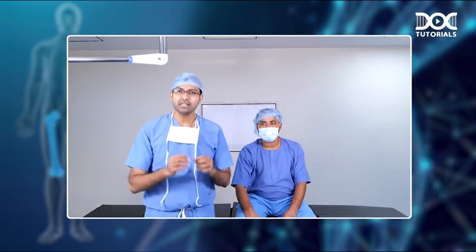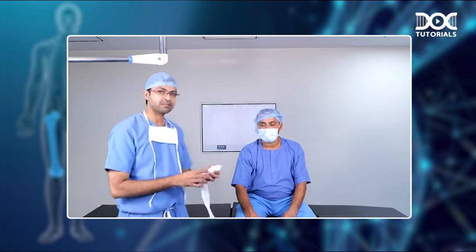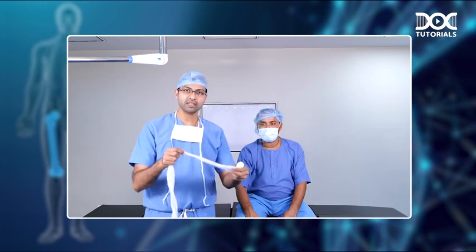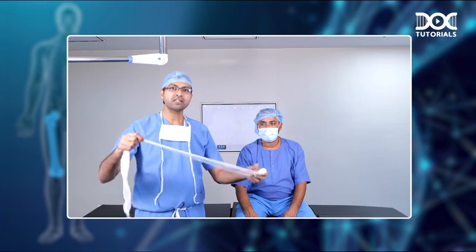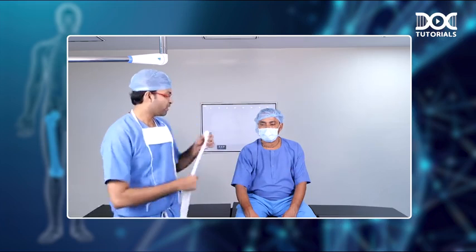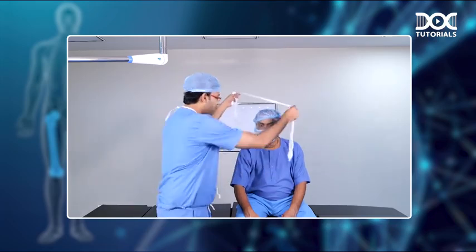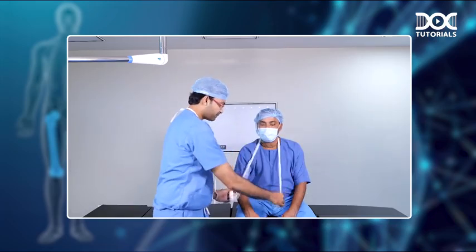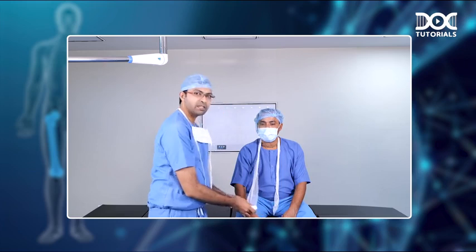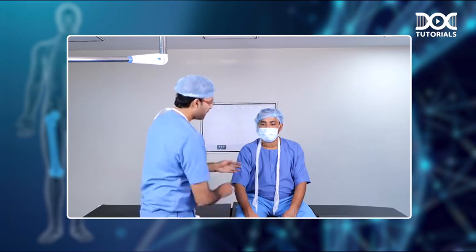The only thing you need here is a roll of cotton bandage, something like this. You take a sufficiently long length of cotton bandage like this, make sure the patient is seated comfortably, and put it around the neck like this. Once you have enough length, you can cut it off at this point.